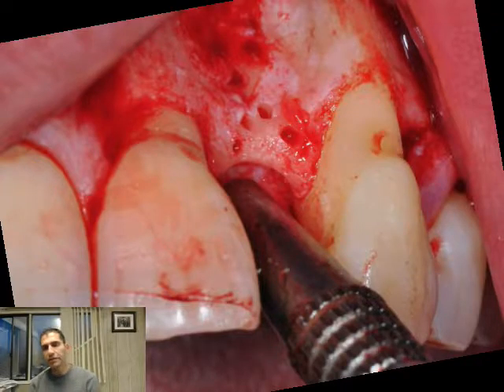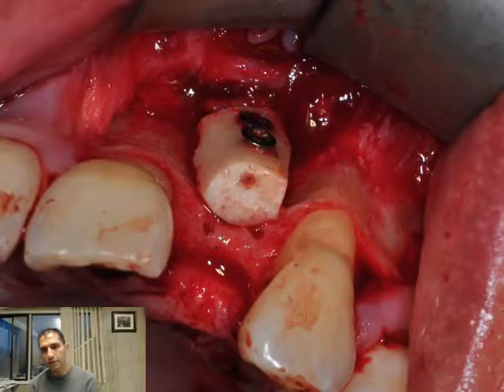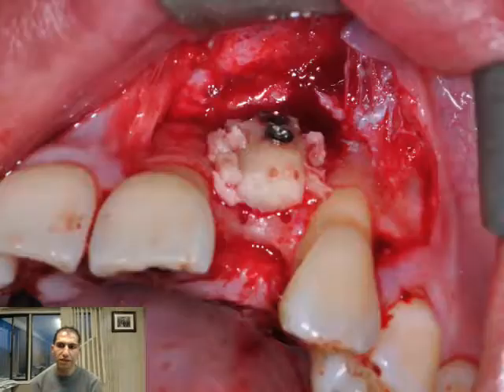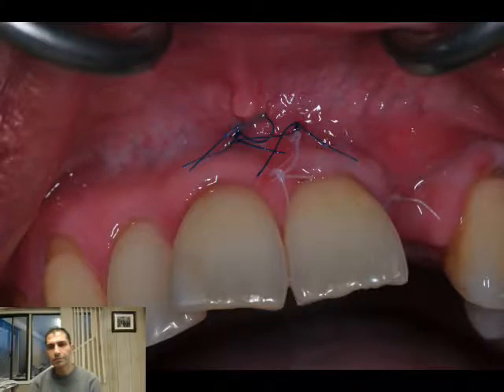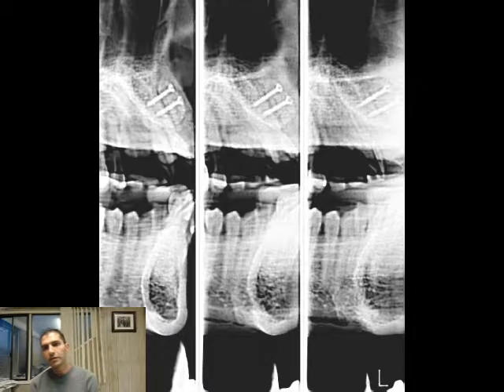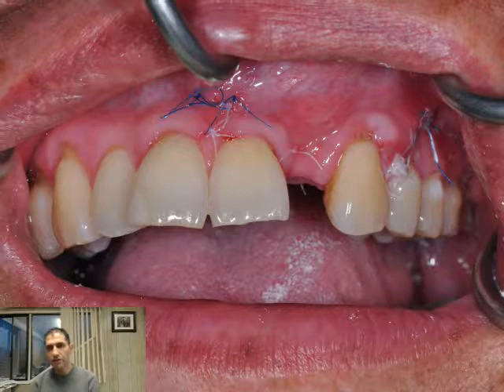This is the freeing of the block and this is the closure. This is the recipient side and here we're decorticating the bone, creating bleeding points. Bifixation is very important for the success of the graft. We're going to remove any sharp angle and then we can add the extra bone.